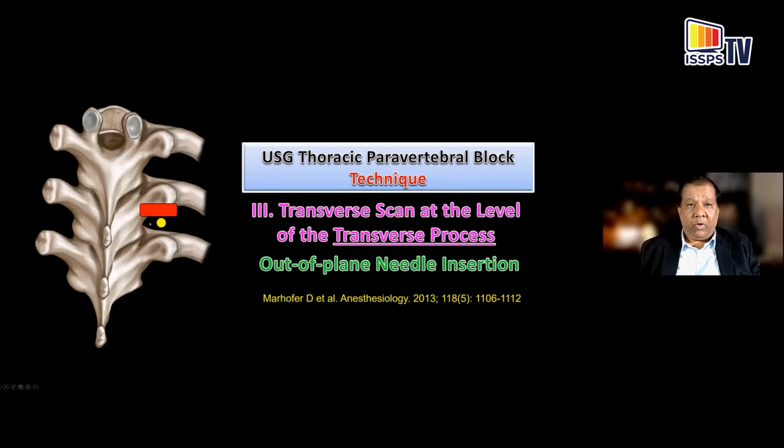You can also perform an out-of-plane technique with the transverse approach. Now, the transverse approach is the next. This is an approach that was first reported by Dr. Shibata and Nishikawa from Japan. And I'd like to present the out-of-plane approach first, then we go to their description.